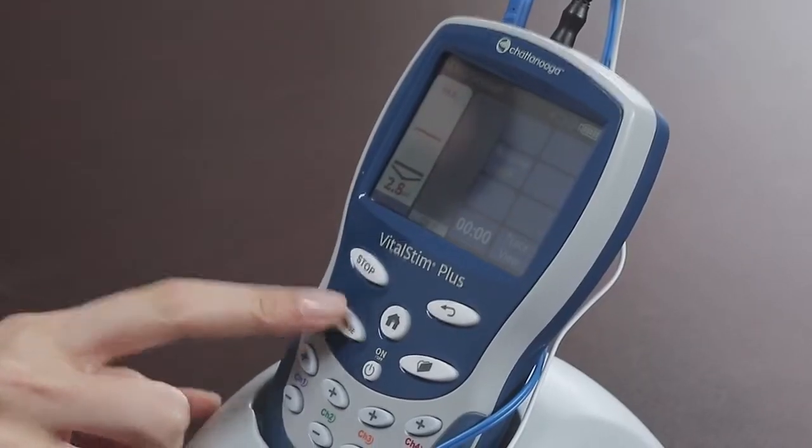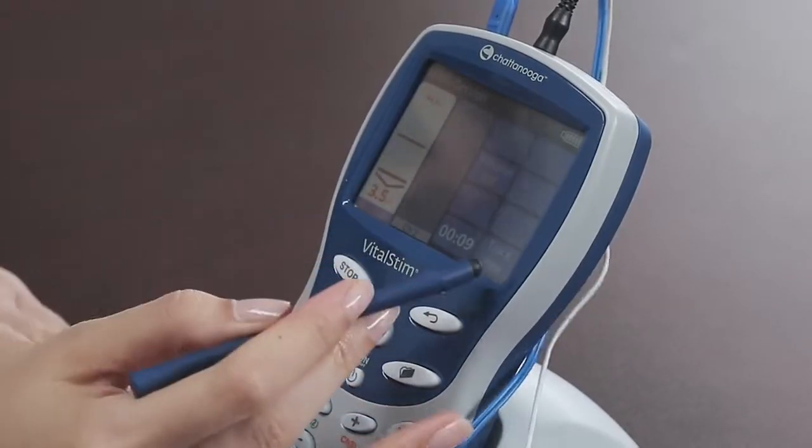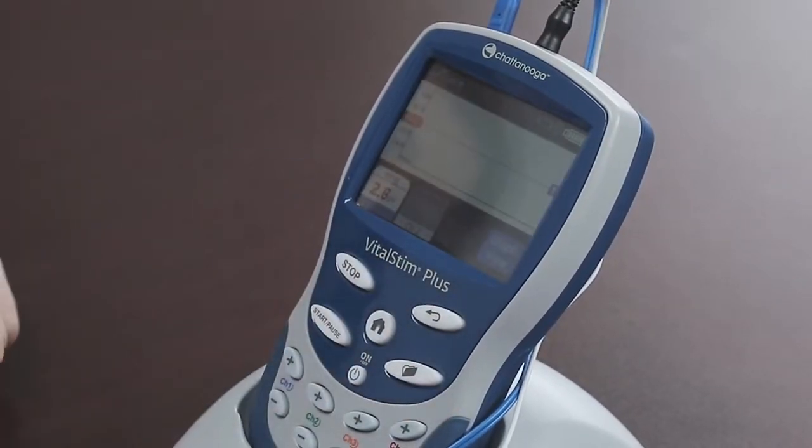Press Start Pause to start recording the session data and ask the patient to contract in such a way as to exceed the threshold. You can do this in this graph view, or you can switch to trace view, which tends to be easier for the patient to work with.